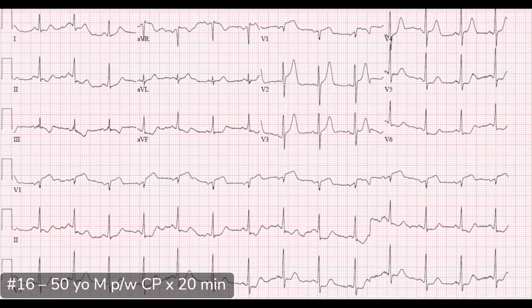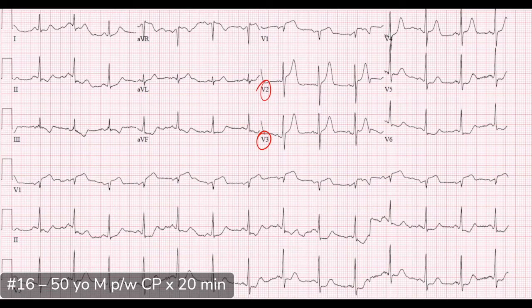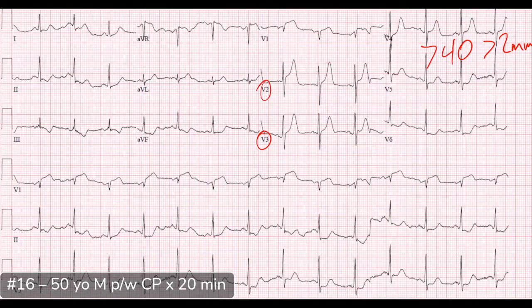Let's talk about the rigid STEMI criteria and why we might disregard it here. Classically, we talk about one millimeter of ST elevation in two contiguous leads, with the caveat that in V2 and V3 the numbers differ based on sex and age. For a 50-year-old male, we'd expect greater than two millimeters of ST elevation in V2 and V3.